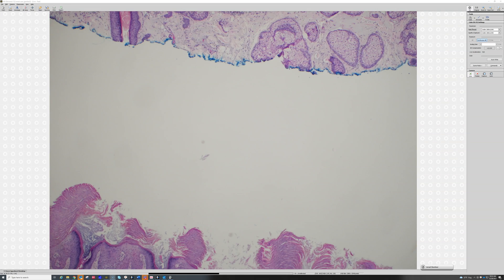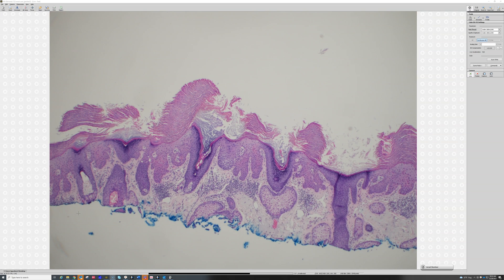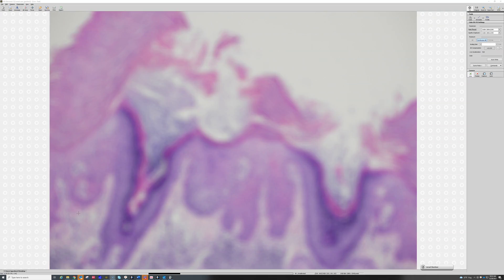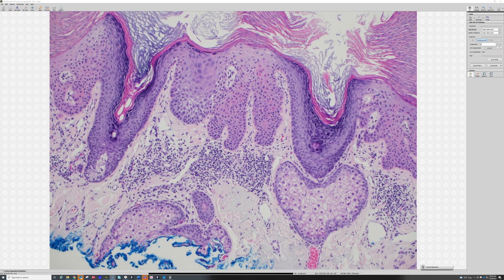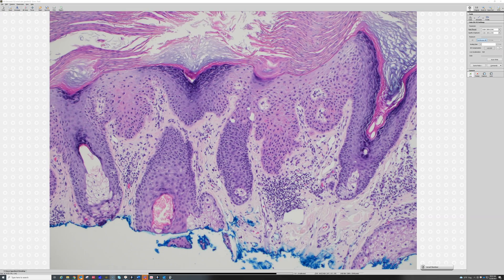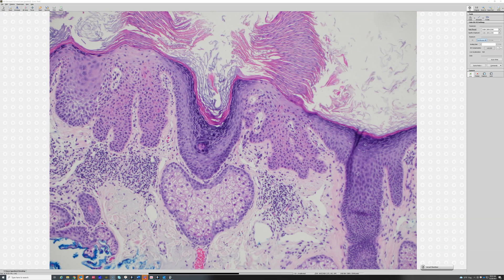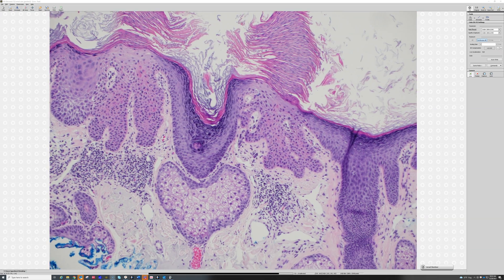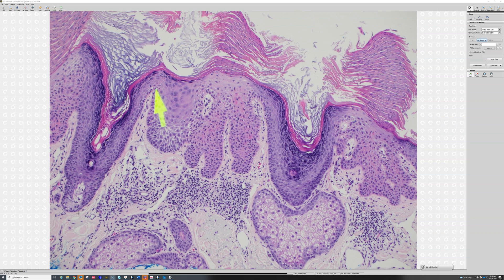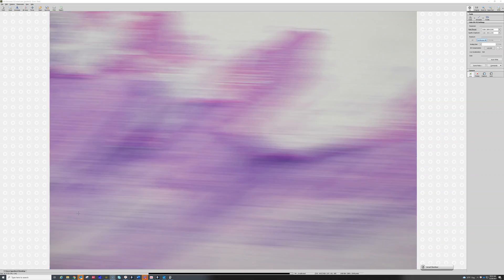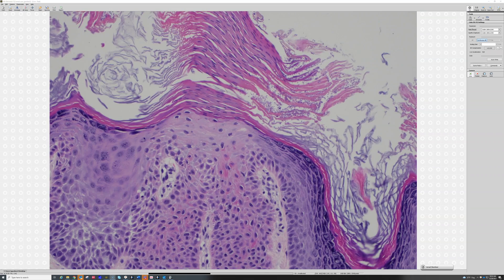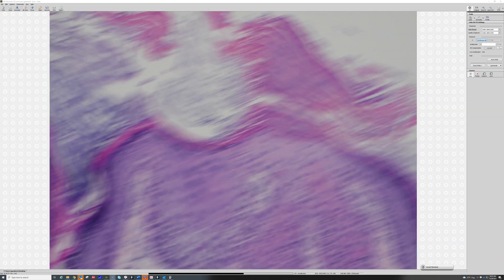You can see that it's characterized by acanthosis, or thickening of the epidermis, jumbled atypical keratinocytes mostly along the basal layer. They're kind of jumbled and disorganized down here, but as they go to the top, they get more pink and mature, and then at the top they get flattened out and then develop into parakeratosis.